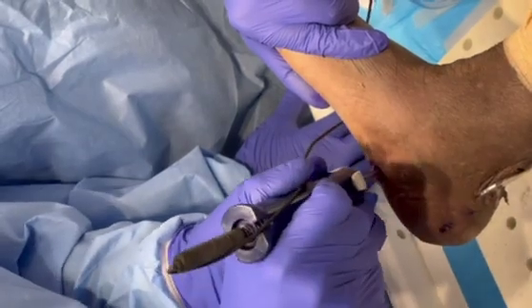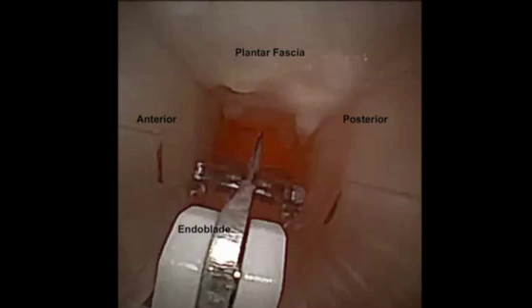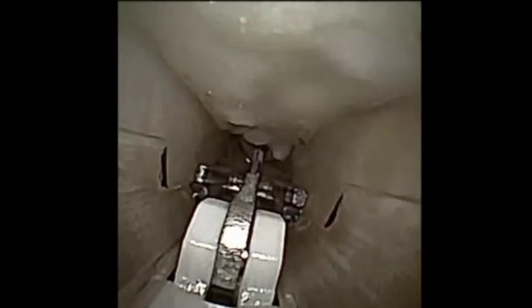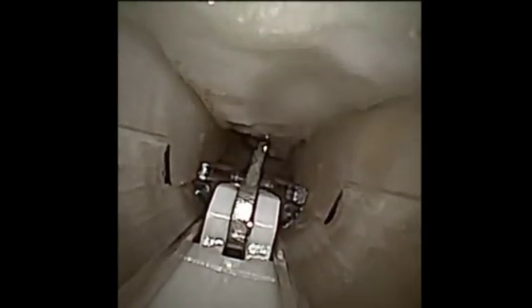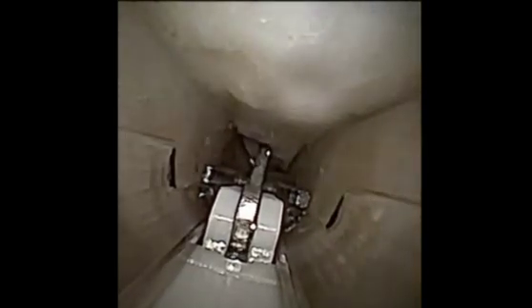The foot should be held in a dorsiflexed position to tension the plantar fascia and surrounding tissues. Once the plantar fascia is visualized, the scope is advanced to the most lateral extent of the fascia, and the endoscopic cutting blade is then released with the tip of the blade directed upward. The blade is then directed from lateral to medial while applying upward pressure for complete release of the fascia.